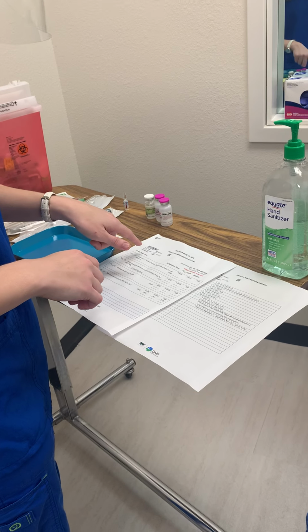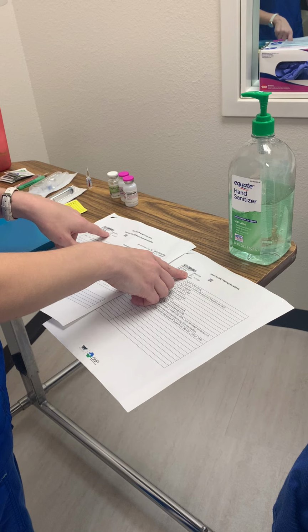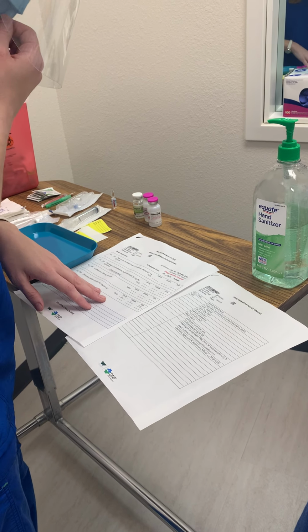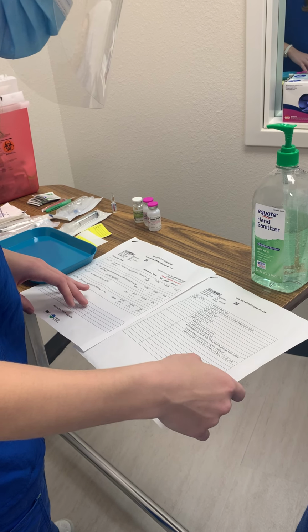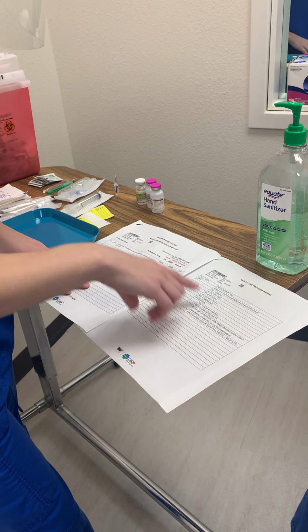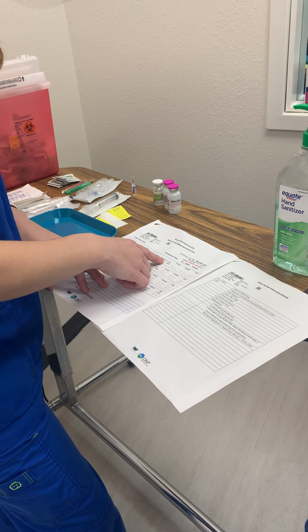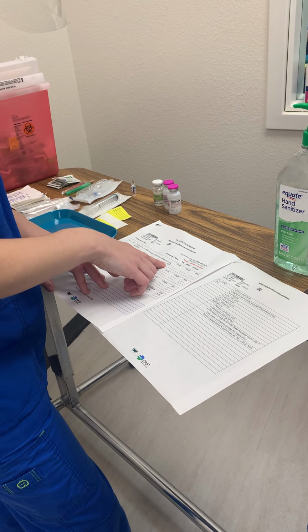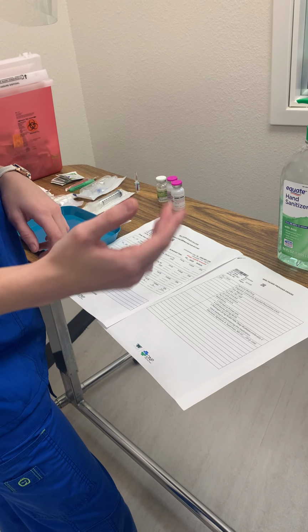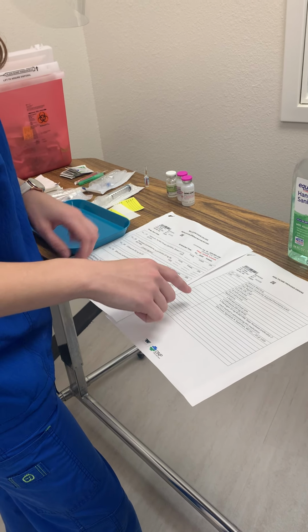So my patient is Shirley Koss. 33-year-old female, date of birth 4/3 of 1987. Shirley came in with pneumonia, and the doctor ordered a PPD test on her right inner arm: tuberculin purified protein derivative diluted 0.1 ml at 10 a.m. Right now it's about 10:45, so I'm within the 30 minutes before and after the time per policy orders, and 1 dose, perfect.